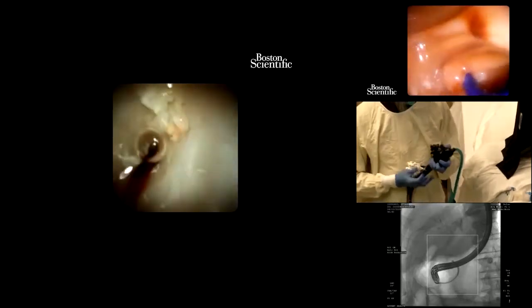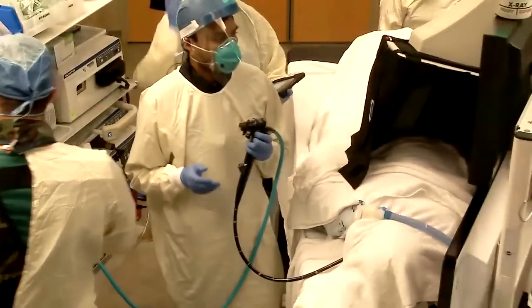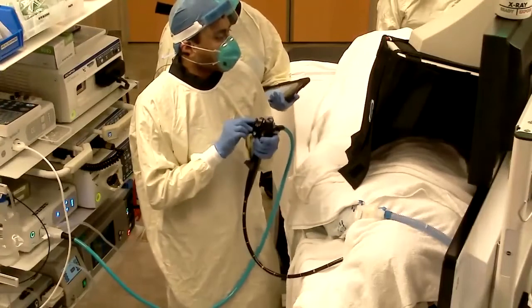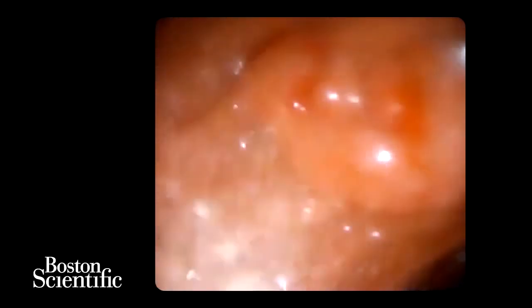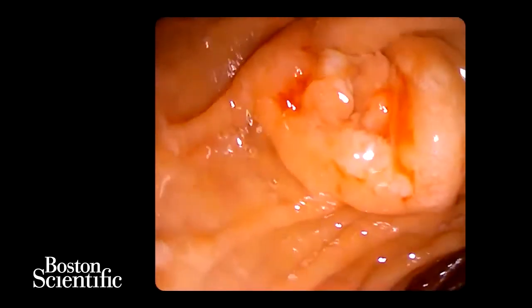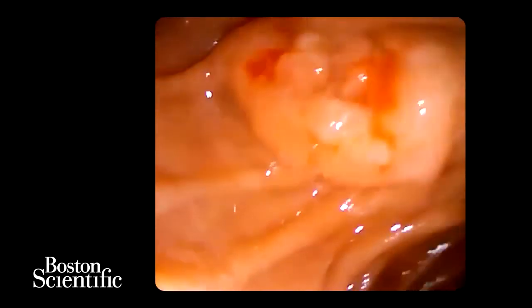Another question was how the elevator feels on the single-use duodenoscope, Dr. V, and whether you can do therapeutic procedures, such as lithotripsy, laser lithotripsy, etc. I mean, we are now performing a therapeutic procedure. I think if you are able to pass a single operator cholangioscope through the working channel, you remember the working channel is, I think, 4.2 millimeters. It is larger than a conventional duodenoscope. So if you can pass your cholangioscope, every other accessory is relatively easy.